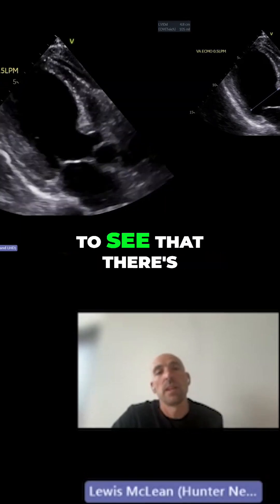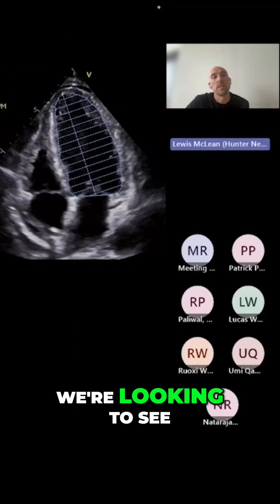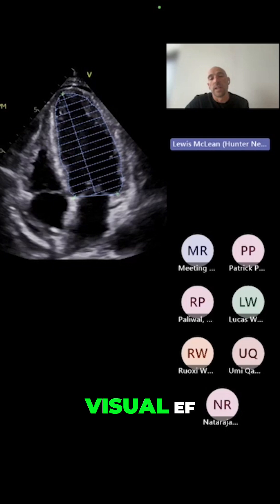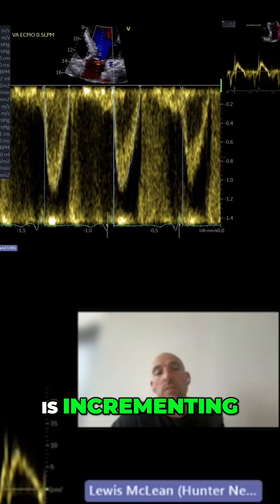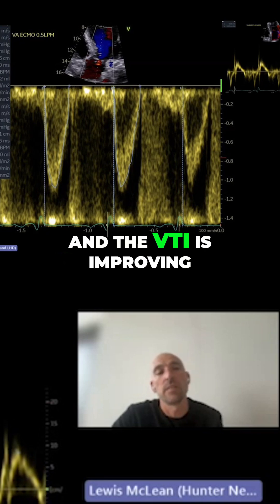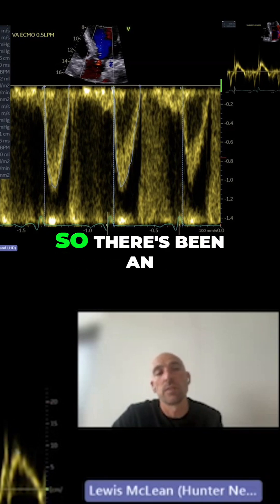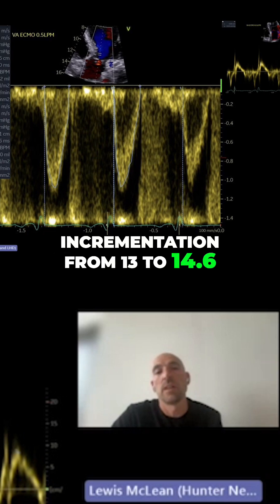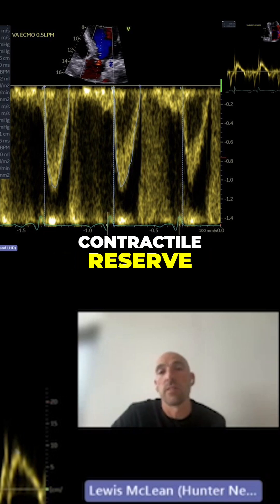We're looking to see there are no signs of LV distension, and that both the visual EF and the measured EF are incrementing. At 26%, the VTI is improving — you can see 14.6 — so there's been an incrementation from 13 to 14.6, which is evidence of contractile reserve.